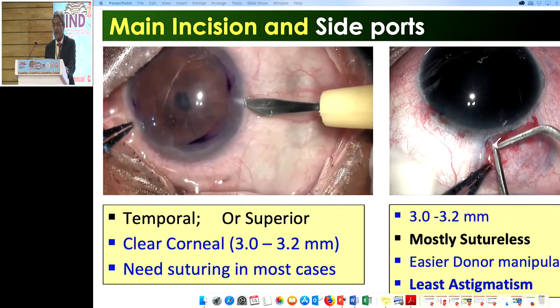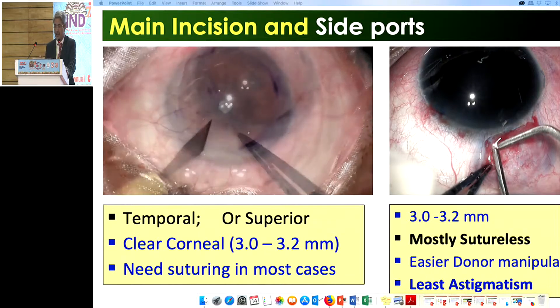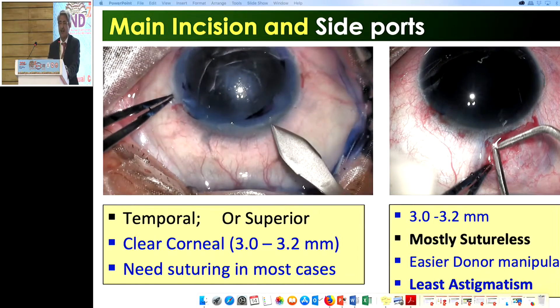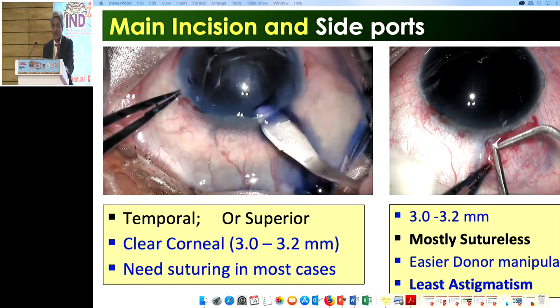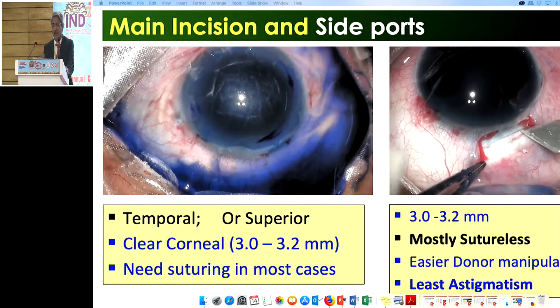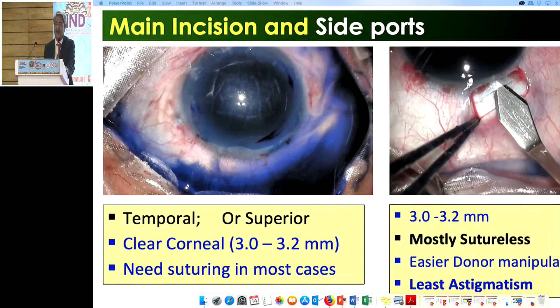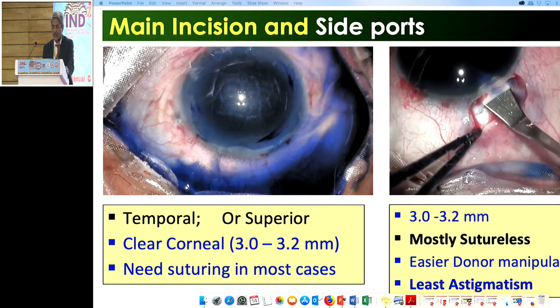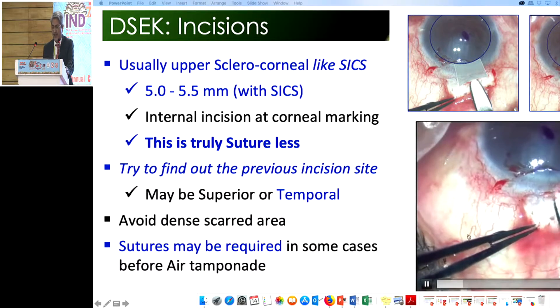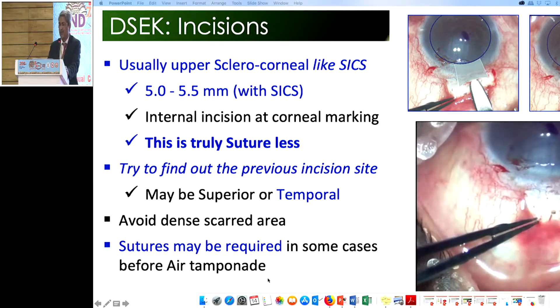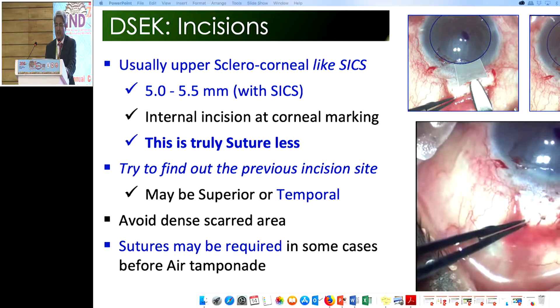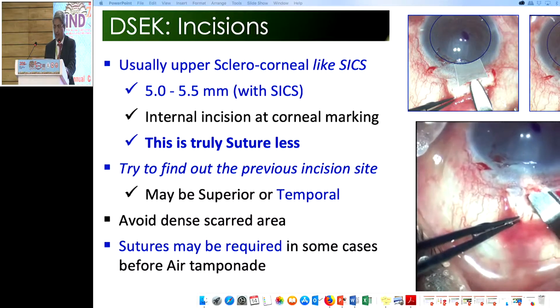For side port entry, the blade should not cross your template mark, otherwise you will have difficulty with air or BSS exchange. For DMEK we go superiorly, but for DSEK you can give a corneal incision; however, it is preferable to use a sclero-corneal tunnel — 5.5 mm, similar to a SICS incision. For the DSEK incision, you need to choose the right area and sometimes need to go a little wider, because the incision is larger in DSEK — usually 5 to 5.5 mm and sutureless most of the time, though sutures are required during tamponade if the air bubble is leaking.